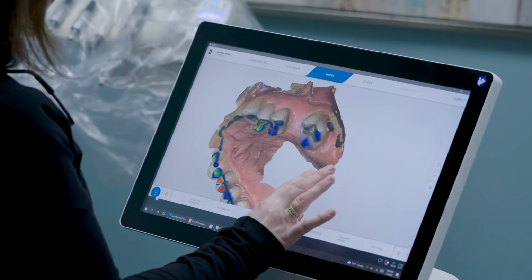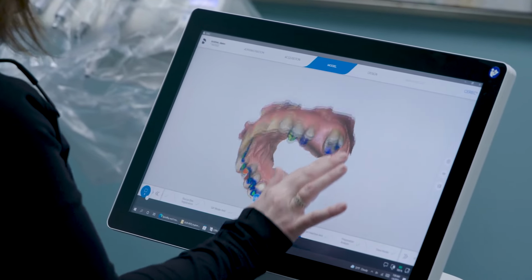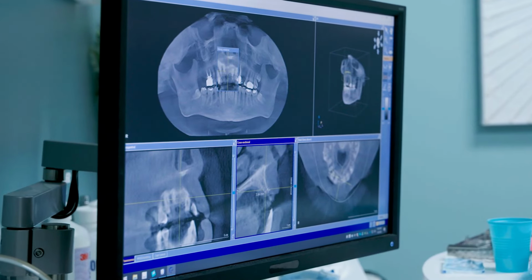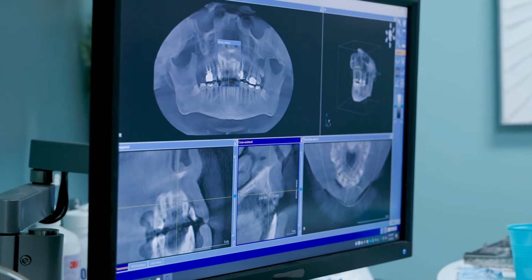He came in and he was missing 2 teeth. He'd had some trauma to his front teeth, so he was missing a front tooth. The tooth next to it is also a little bit loose, and so we know we're going to need an implant down the road, but we decided to make a treatment plan that was kind of extended to give him a front tooth to be solid first before we remove the second one. He was also missing tooth number 13, which is an upper left premolar, and he was ready for some implants.